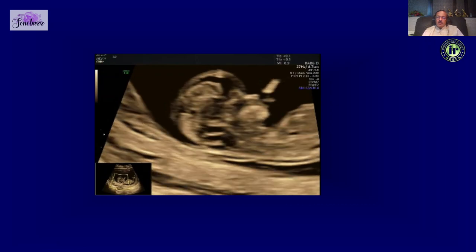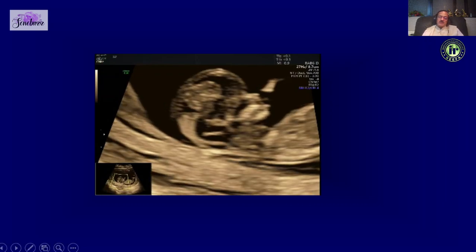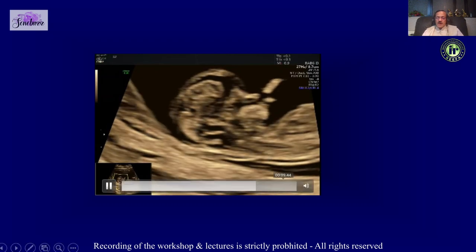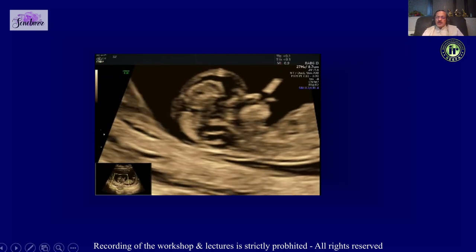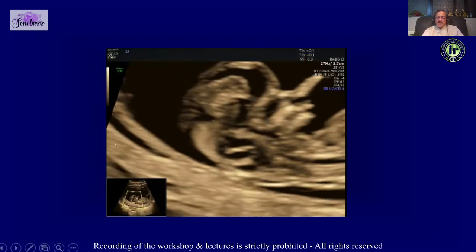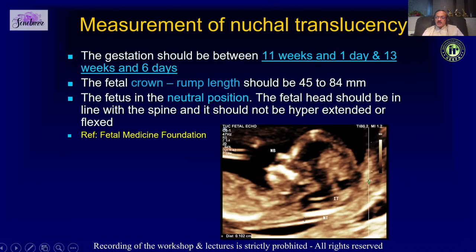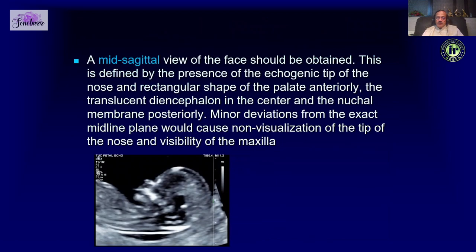To measure NT, hope that the fetus gives you a good position — sometimes you just have to wait. Once you get the fetus in the right position, gradually zoom in until you get a good nuchal translucency section where you should see the head and only the upper mediastinum. Timing should be between a CRL of 45 to 84 mm.